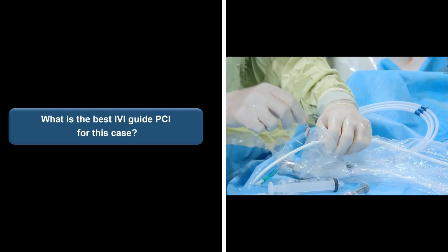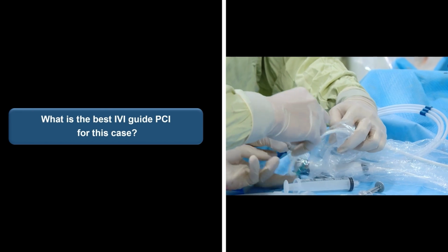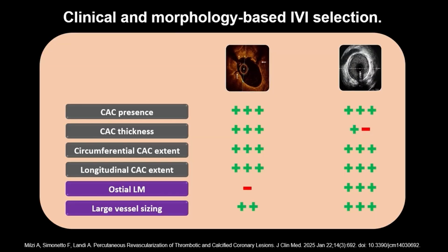So what is the best intravascular imaging guided PCI for this case? OCT is superior for visualizing calcium distribution and predicting side branch occlusion. However, IVUS is preferred for visualizing the lesion at the ostium left main. So, if I can, I choose both.